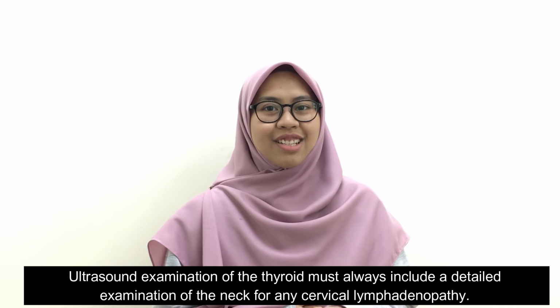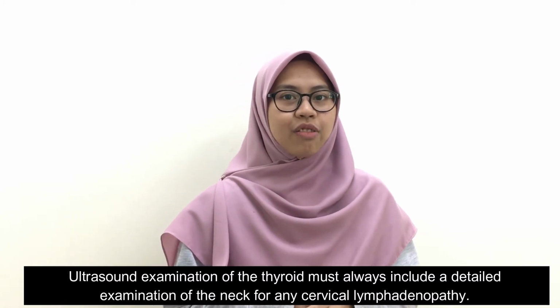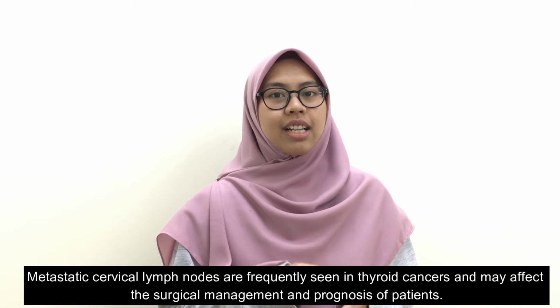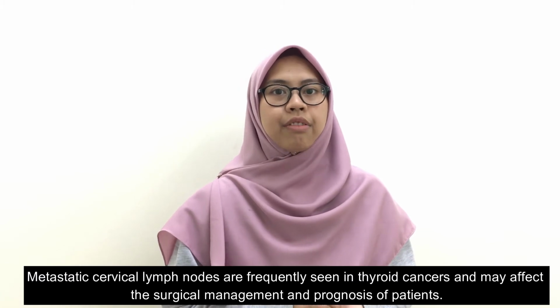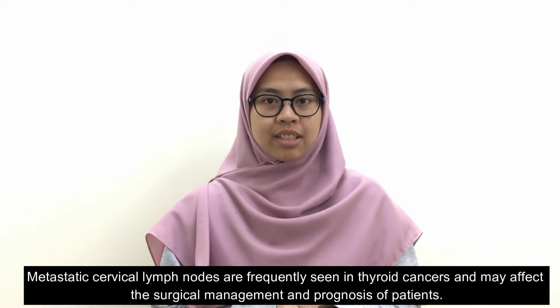Ultrasound examination of the thyroid must always include a detailed examination of the neck for any cervical lymphadenopathy. Metastatic cervical lymph nodes are frequently seen in thyroid cancer and may affect the surgical management and prognosis of patients.